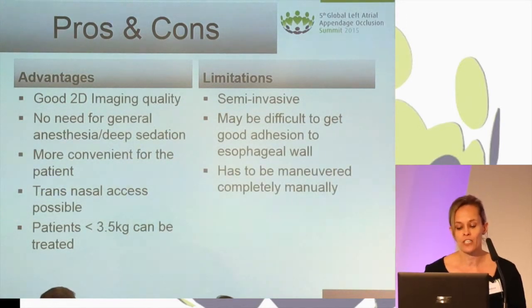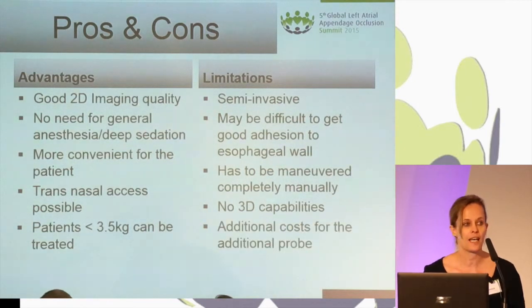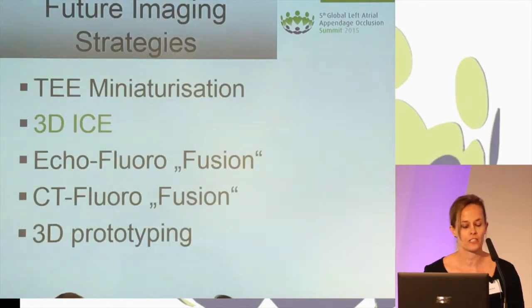It has to be maneuvered completely manually, which you have to become used to if you use this probe, and we don't have any 3D capabilities at the moment. And, of course, we have additional costs for the additional probe if you use it.